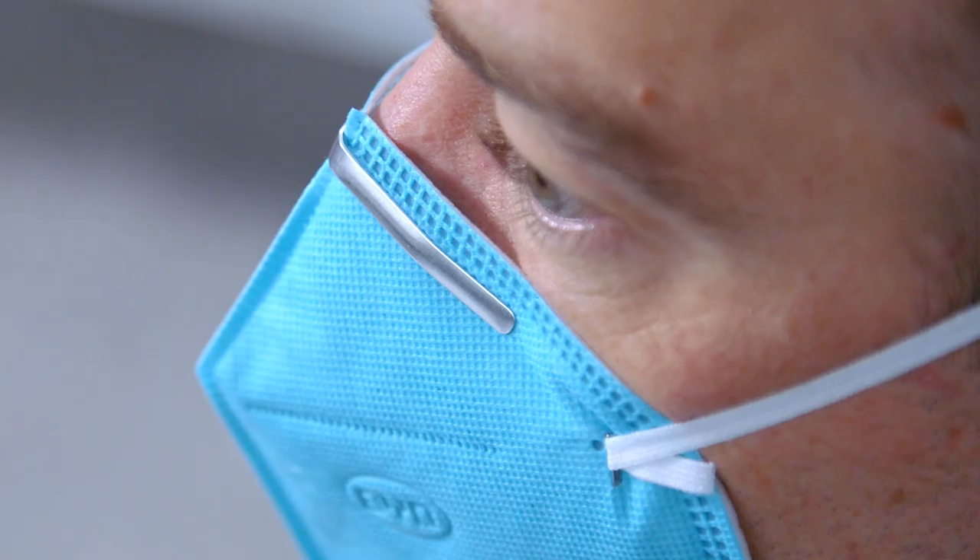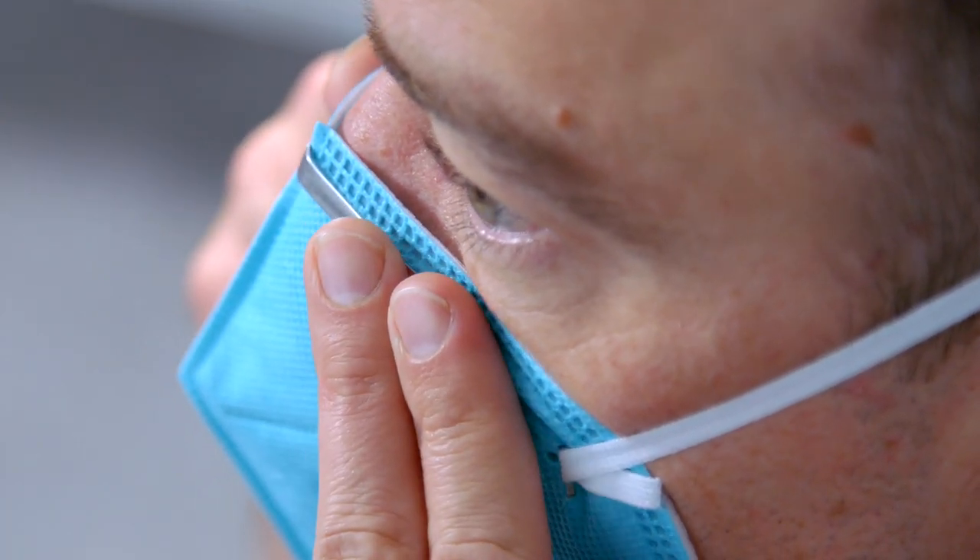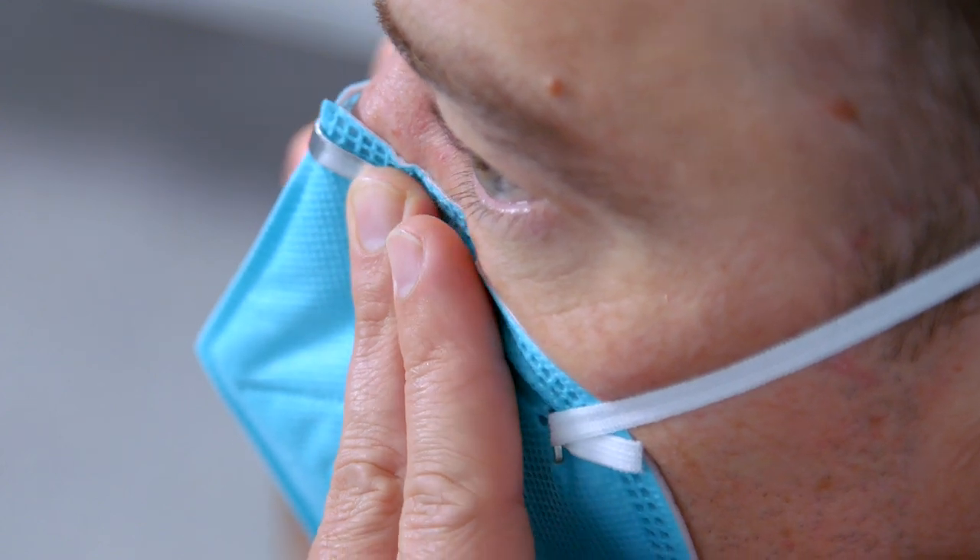Using both hands, mould the nose clip to the shape of your nose bridge by pushing inwards while moving your fingertips down both sides of the nosepiece.